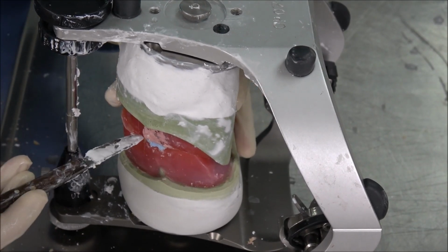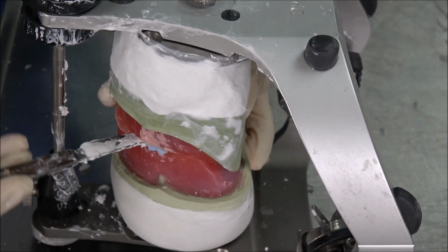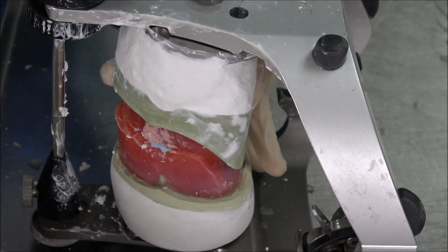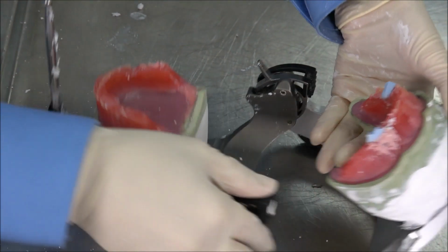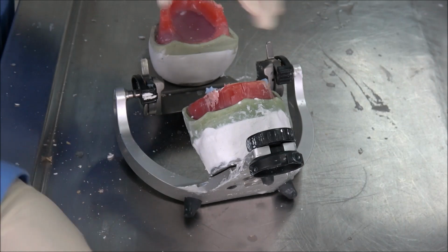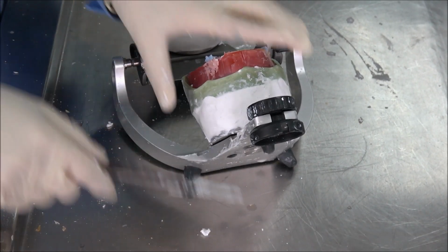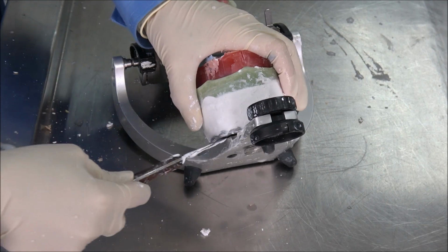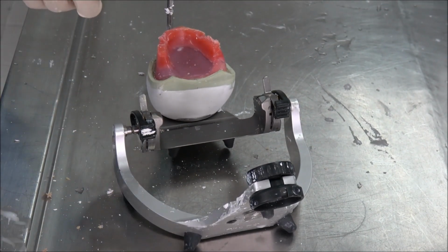We remove the upper and lower. Just roughly. Okay. Slowly remove. Okay. So we remove. And now once it's set, we can only take out and remove from the articulator. Okay, everyone, can you see here?